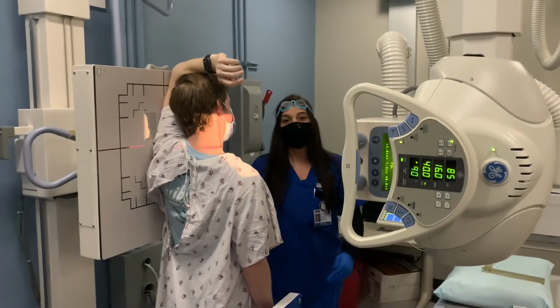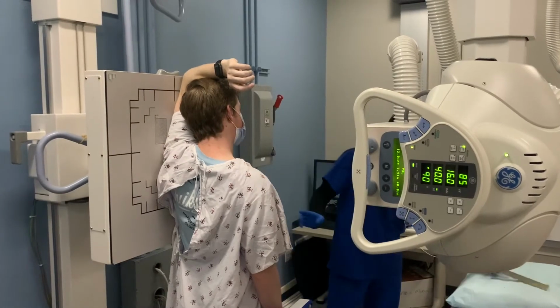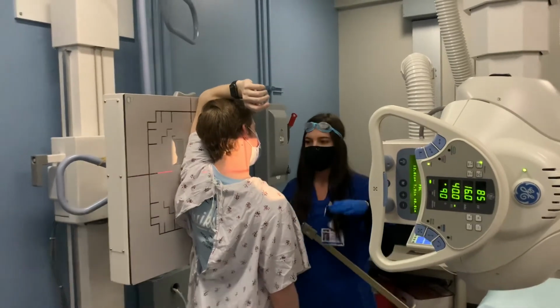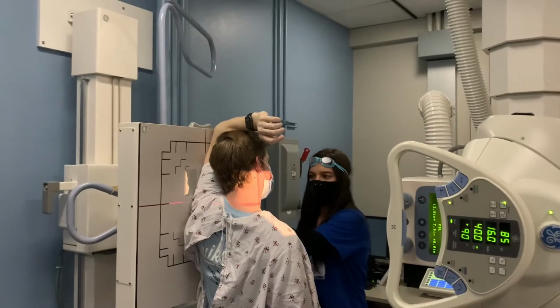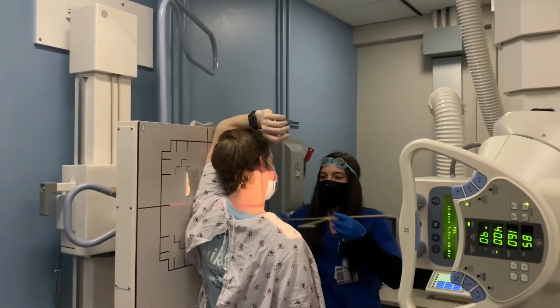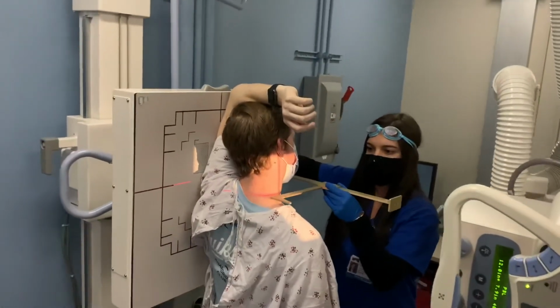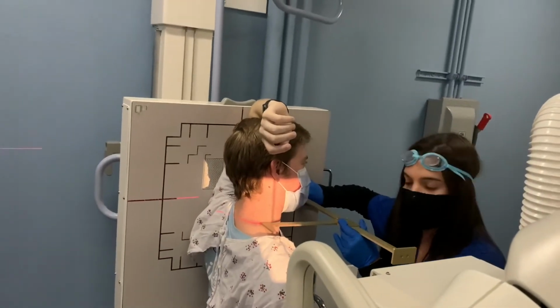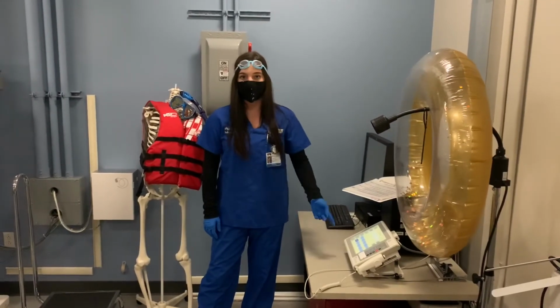After our patient is properly positioned, it's time to get our technical factors. We're going to grab a caliper and we're going to measure part thickness. It's important to make sure when you are measuring that you have one part of the caliper here where the central ray enters and the other part against the IR. Just like this. This part thickness measures at 26 centimeters. Now it's time to go put it into our console.